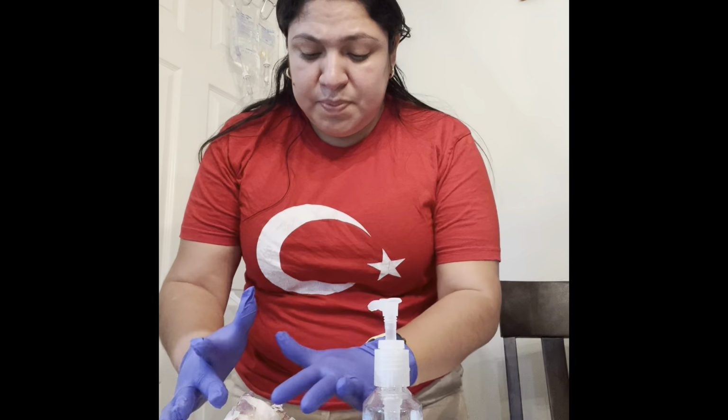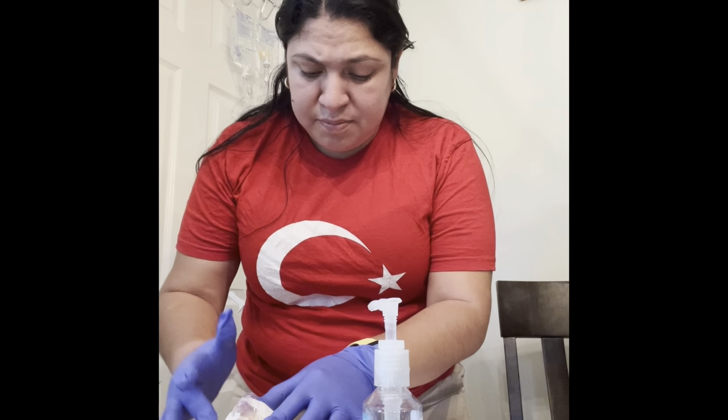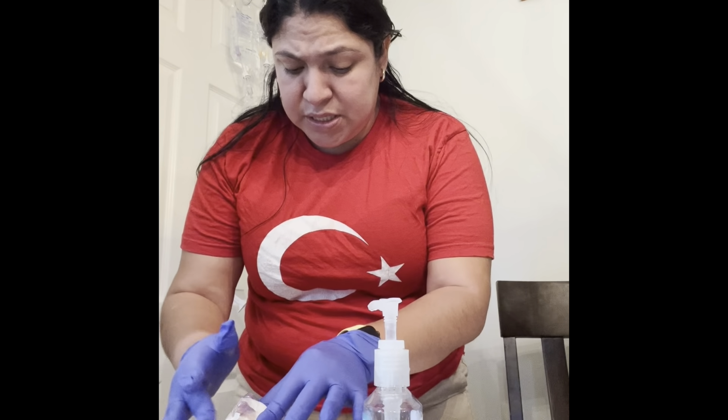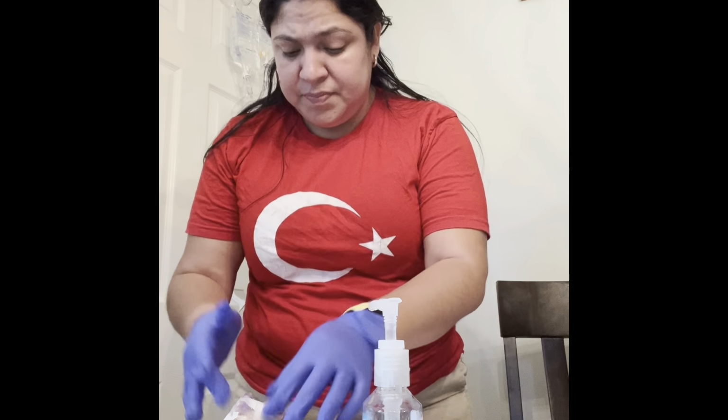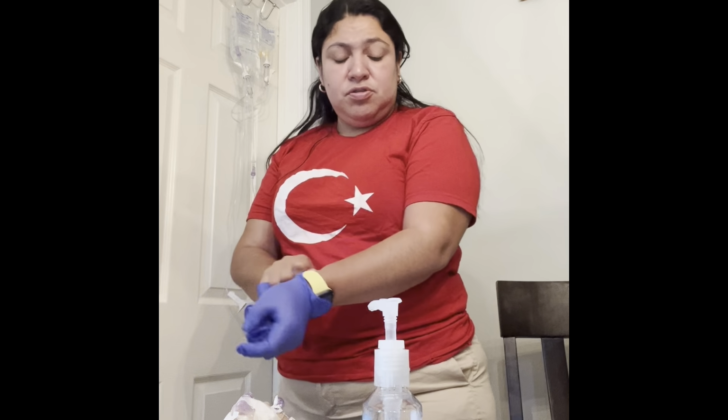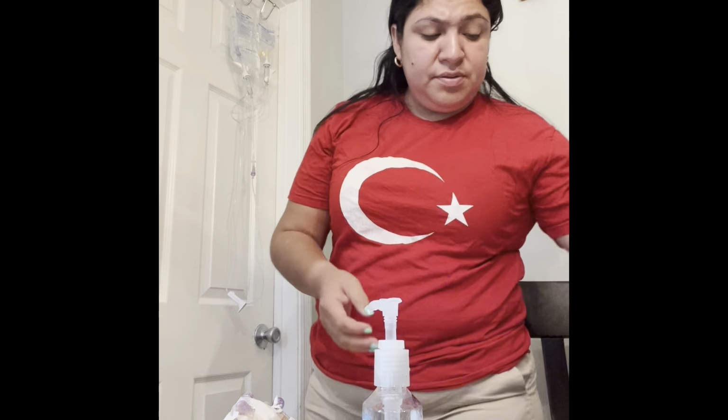I am going to inspect your IV access, Mr. Rene. I'm going to be checking for infiltration. Do you have any pain, Mr. Rene? Mr. Rene stated that he doesn't have any pain. So I'm going to take off my gloves, and I am going to do my third check verification.